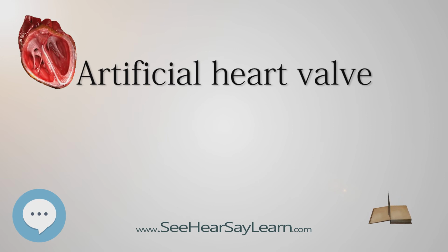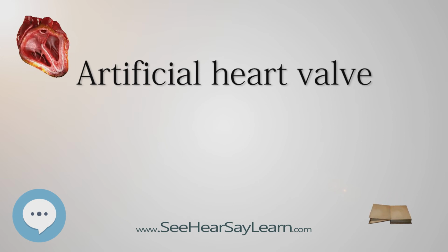As a result of a number of disease processes, both acquired and congenital, any one of the 4 heart valves may malfunction and result in either stenosis, impeded forward flow, and/or backward flow, regurgitation. Either process burdens the heart and may lead to serious problems including heart failure. A mechanical heart valve is intended to replace a diseased heart valve with its prosthetic equivalent. There are 2 basic types of valves that can be used for valve replacement: mechanical and tissue valves.